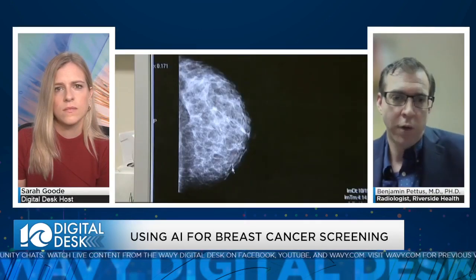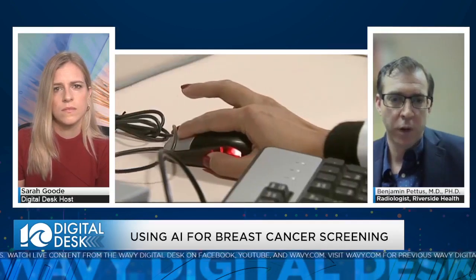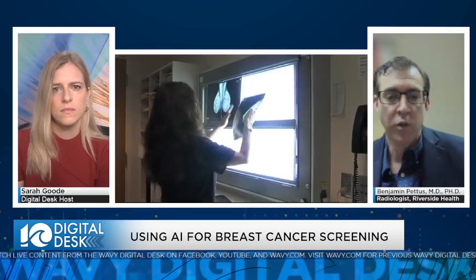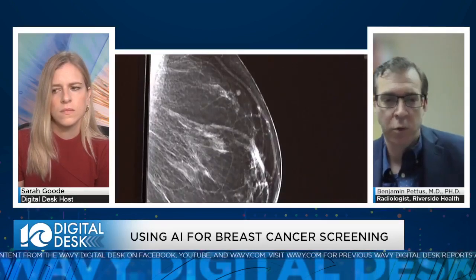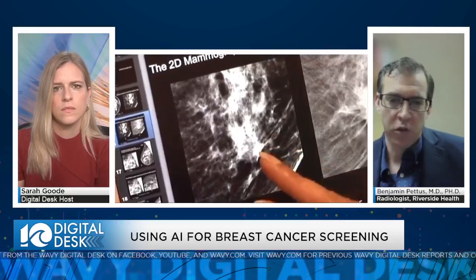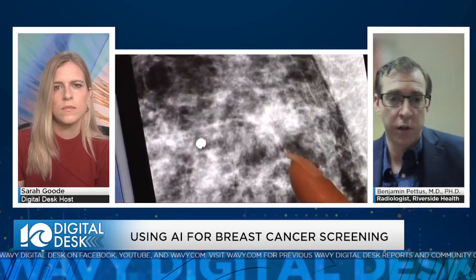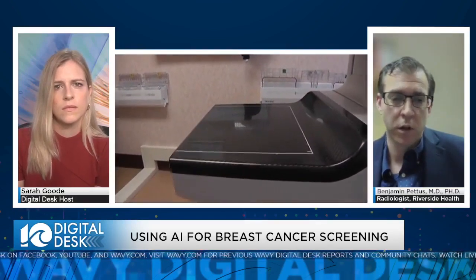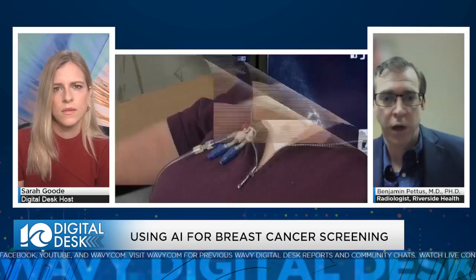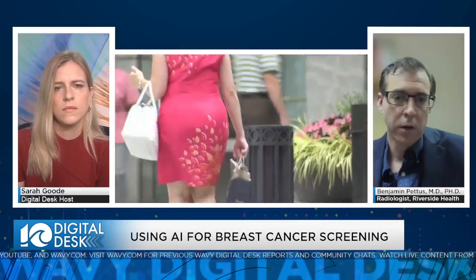So everybody's always trying to err a little bit towards caution, and there is a certain amount of statistics, and a certain amount of conversations with patients. This area is really low suspicion, but we need to sample it, or this one's higher. So the AI information of the morphology brings in the statistical experience from a million cases it's trained on, and that's a growing database. We've had cases that we found that it initially didn't find when we did a review. So we've given those cases to the database, so it's only going to get better going forward.